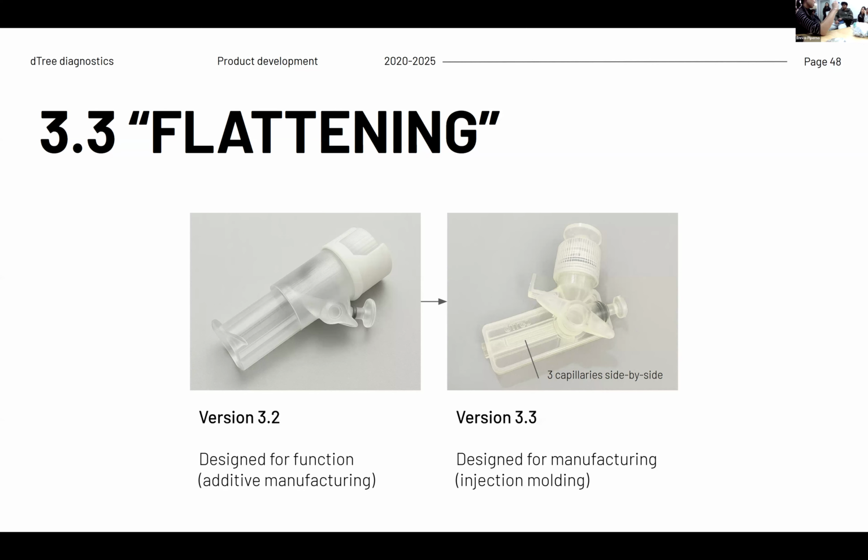And then from that point on, you just turn it to the first set and then same thing, tap it out until it's empty. And then you can do the second multiplex, tap more sample in and transfer onto the other one. And then once you have transferred both, that's when you lock it back. So now what you want to lock is the two pairs of reaction chambers. And then you just dump it in the water for 40 minutes, and then you'll see your results from here.